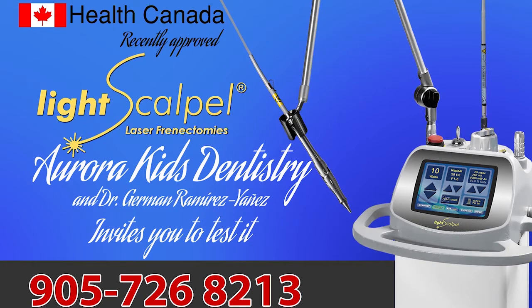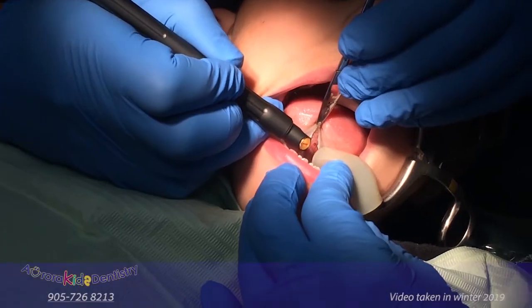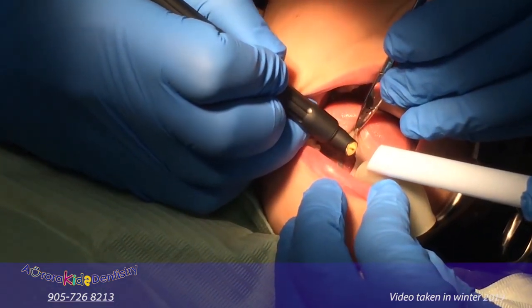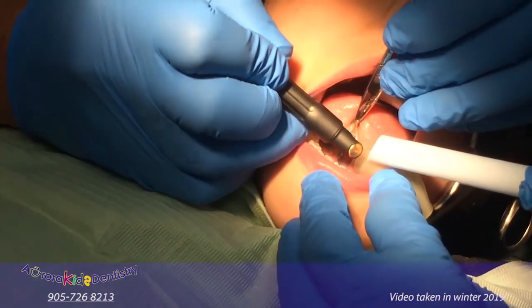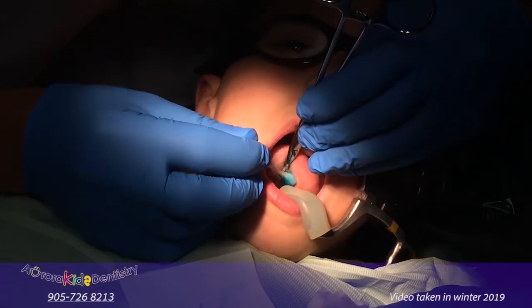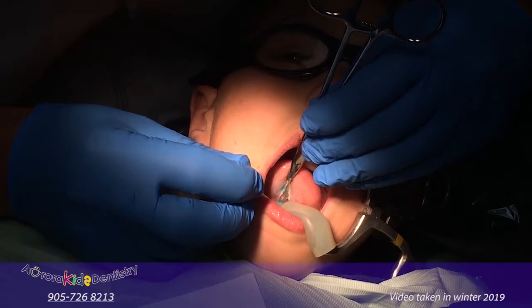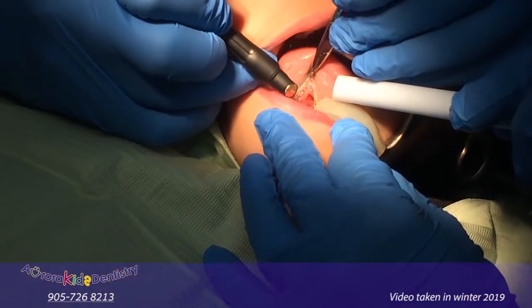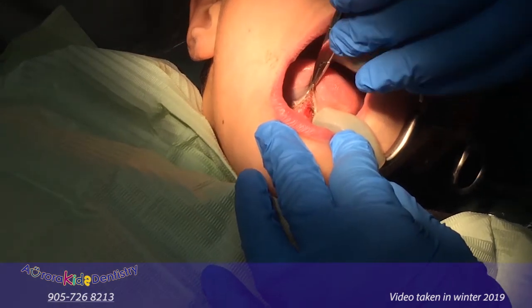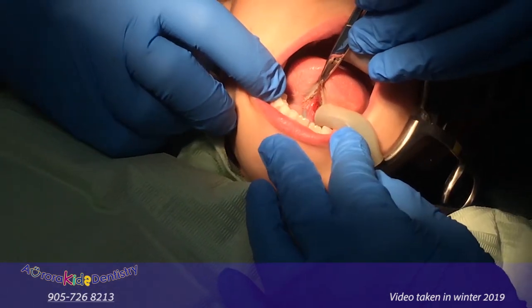In Aurora Kids Dentistry, we have the CO2 laser, which is one of the latest versions of the laser to do the frenectomy. And you can see that we can do the frenectomy just with topical anesthesia. We don't need to use needles, which is a great advantage for the kids. We don't have the risk of bleeding, so we don't have to put in stitches.